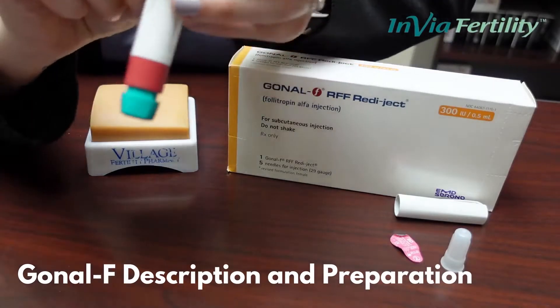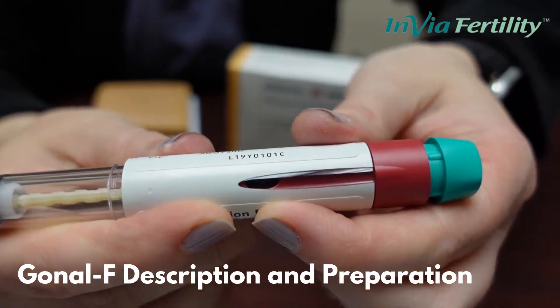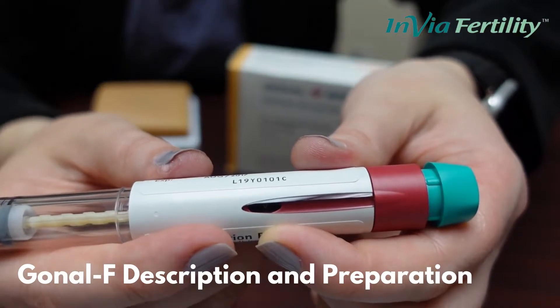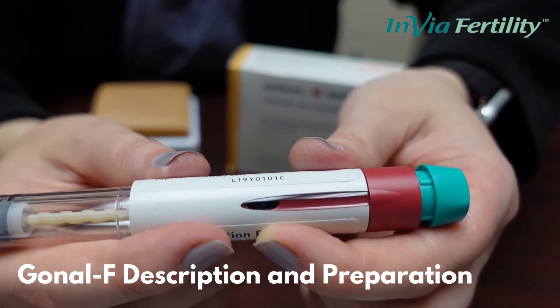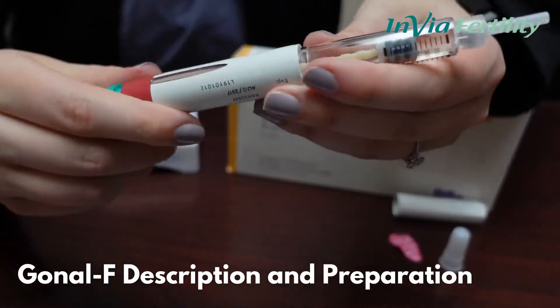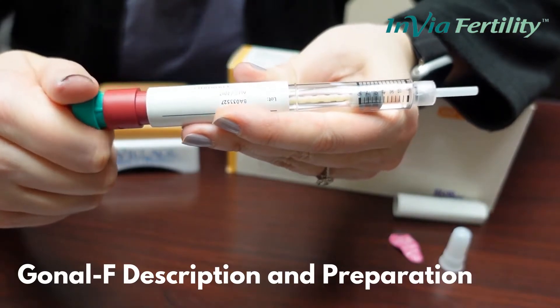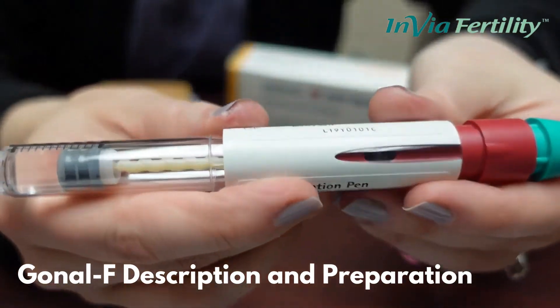When you turn the pen you can look at it — you will see a window and it will be at zero. Whatever your dose may be, you are going to dial that to your dose every night. For example, if my dose is 150 units, I am going to use the pen and turn it away from me until I can read 150 in the window.